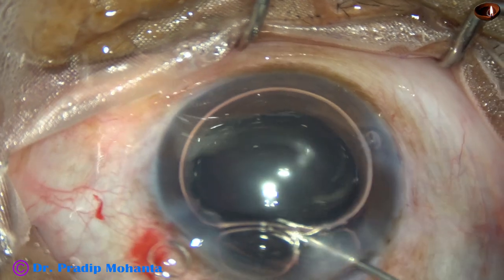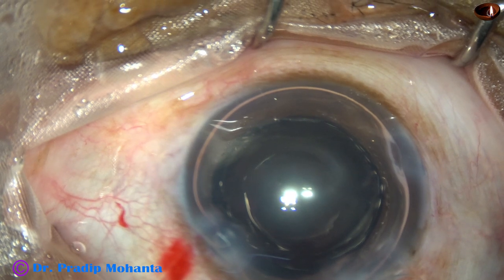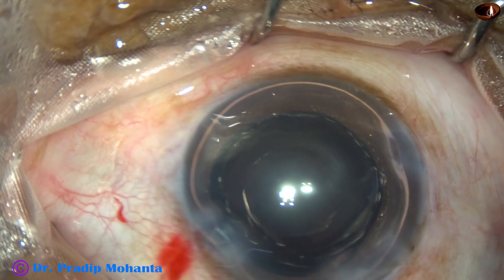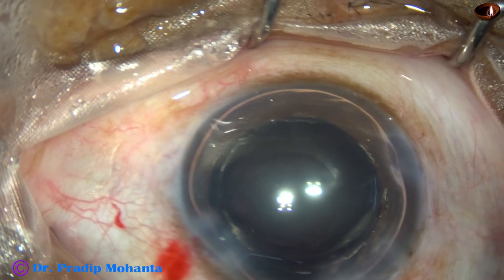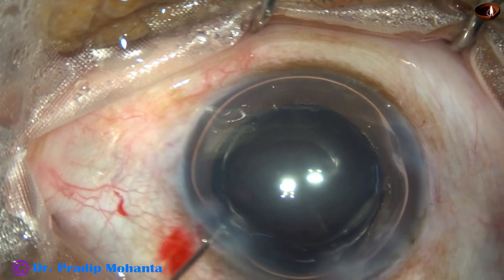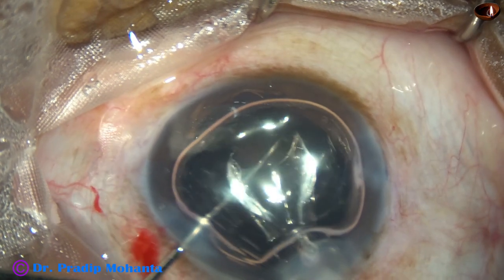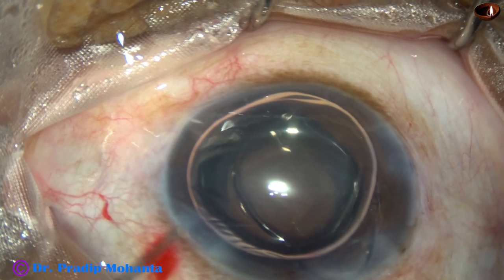I inject air. I enlarge the main incision, which has not been shown in this edited video. Now I inject the intraocular lens over the iris — I don't try to place it in the sulcus directly — and place it over the iris, then boost the lens into the anterior chamber.